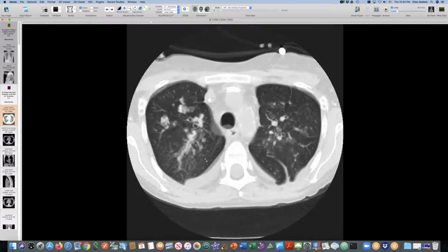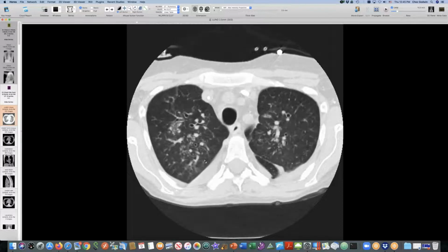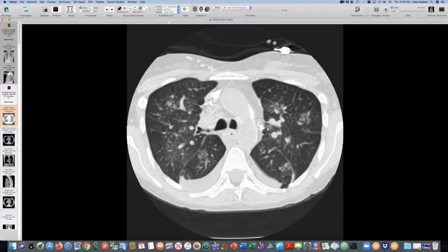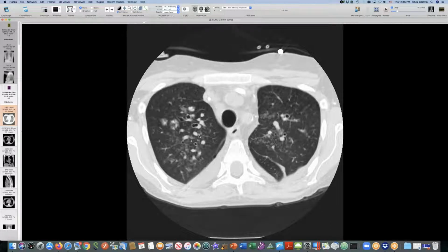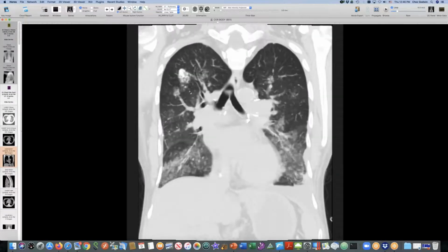So if you want to precipitate calcium, you want to be in a basic part of the lung. And it turns out that the lung ventilation is better in the upper lungs, and so carbon dioxide is being removed. The lung bases are more acidic, and the lung apices are more basic. And so the metastatic calcification tends to be in the more basic parts of the lung. It's usually in the upper lungs for that reason. At least that's the after the fact rationalization. That sounds really good to me. So metastatic calcification, and let me show you on here, see the nice distribution of these bigger, denser blobs up here.